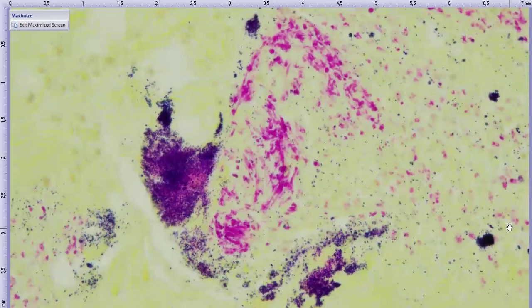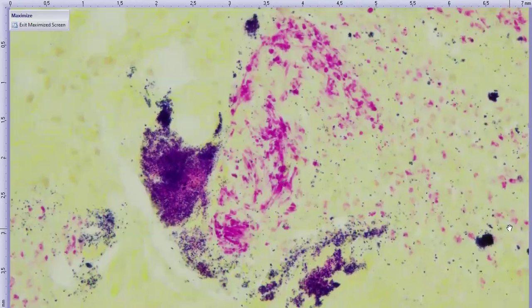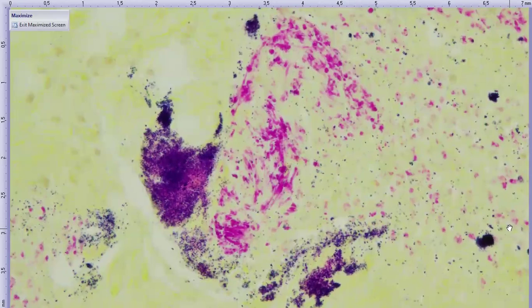I inquired of the clinician in my comments whether there was any history of oral or nasal disease. This was ventronasally located in the orbit, or at least the piece that was still attached to the eye was ventronasal, since it was deep to the third eyelid gland. I never heard back from them, so I'm not really sure what the origin of this is. I would sort of assume that this is some sort of traumatic injury, or at least some sort of defect that developed either to the skin or to the oral cavity.